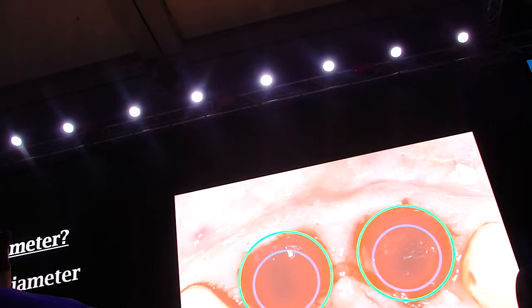So, which diameter? 15 years ago, we heard people on stages like this saying, fill the gap, fill the socket with an implant. Take a wide diameter implant to get a good primary stability. Well, nobody obviously will place today a 5 or 6 millimeter diameter implant in a central incisor socket in the maxilla. Everybody will take a small diameter and go off to the oral side. And although everybody agrees that we do this, still keep in mind why people do this, because sometimes the reasons are mixed and not clear.